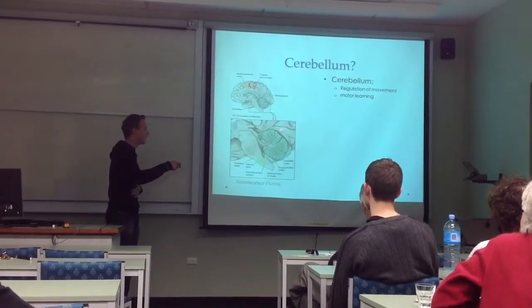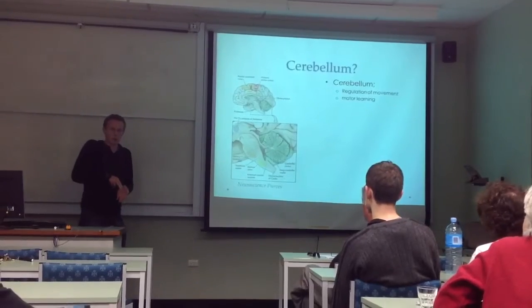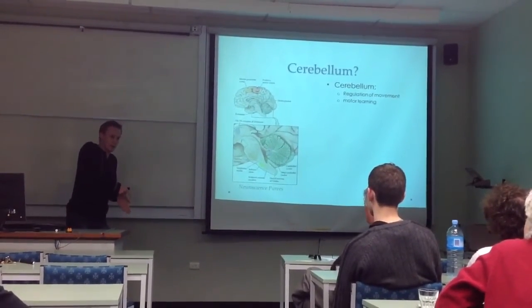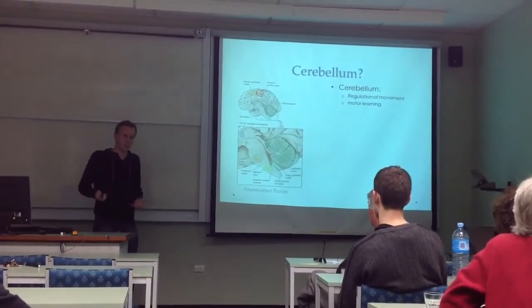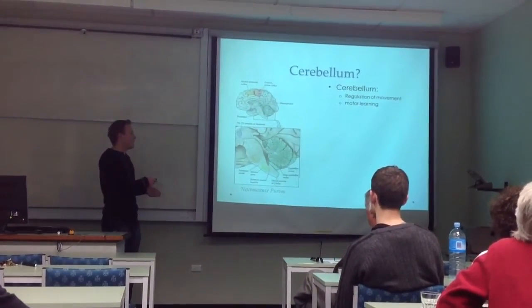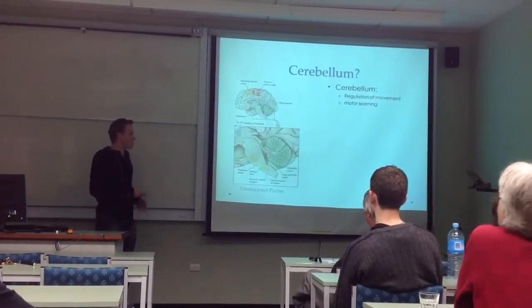Physiologically, we would want to image from the outside of the brain, just drill a small hole in the skull and image the cerebellum and see right through to the DCN and get all the information out we can. So that's why we started with trying to examine the most physiologically applicable region.